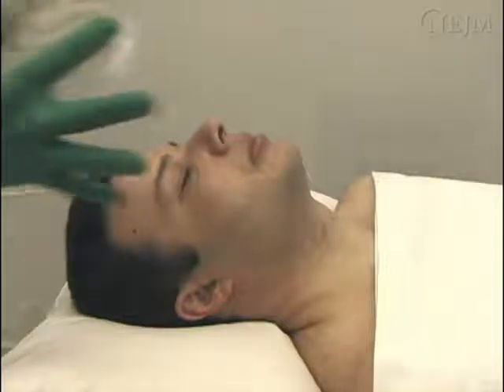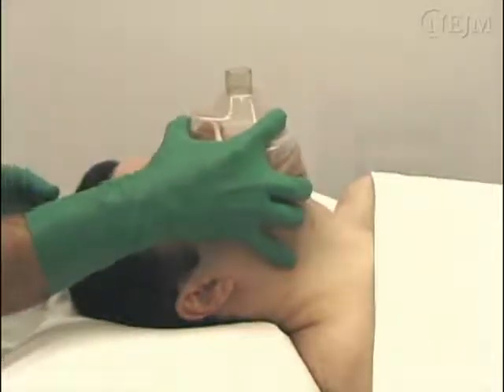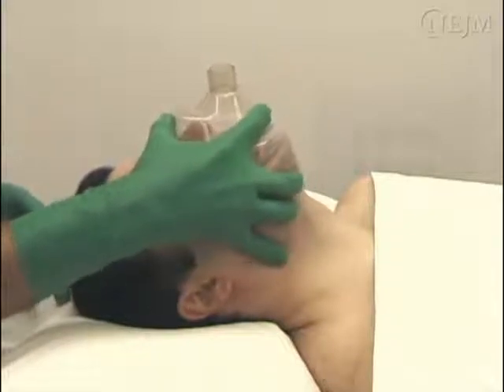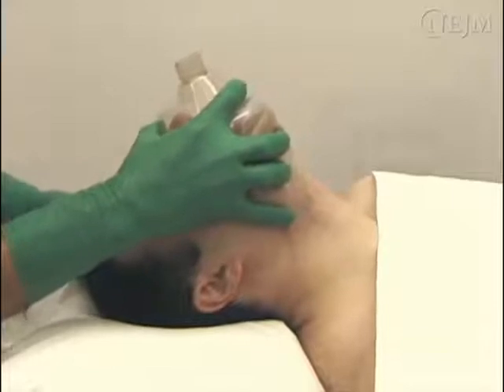The most common method to hold the mask consists of placing the thumb and index finger on the body of the mask while the other fingers pull the jaw forward and extend the head. The middle and ring fingers are placed on the ridge of the mandible.